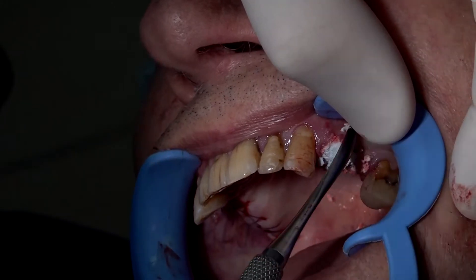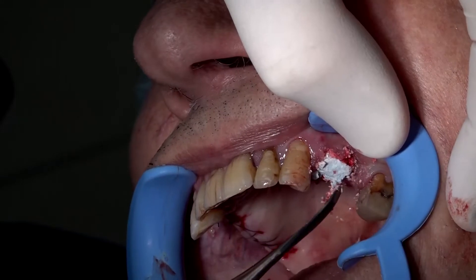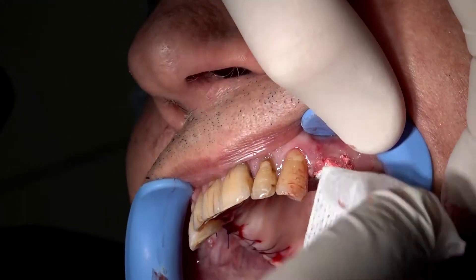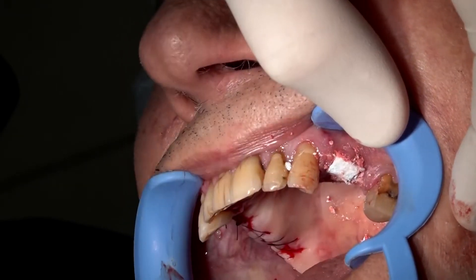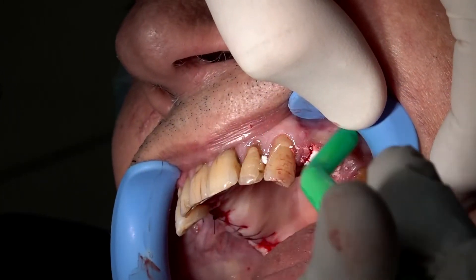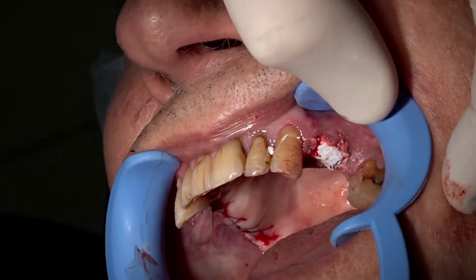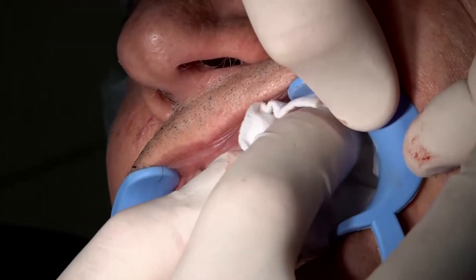We will need to protect the area by using the AuraAid, which is an adhesive band that we will secure by cross suturing above it. Before using the AuraAid, it is important to clean the area with a gauze and then to wet it a little bit. So, we use a moistened gauze, not too much, and clean the area.